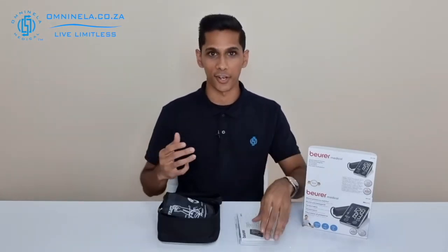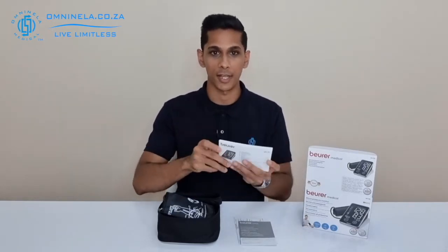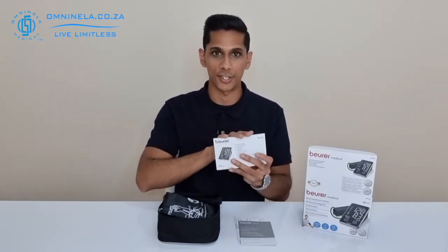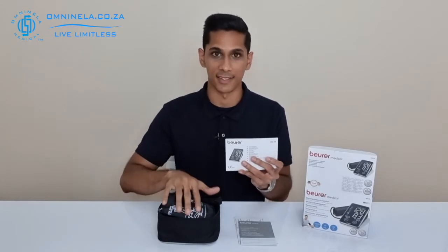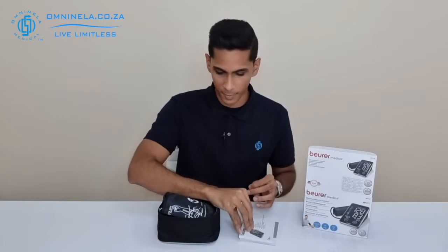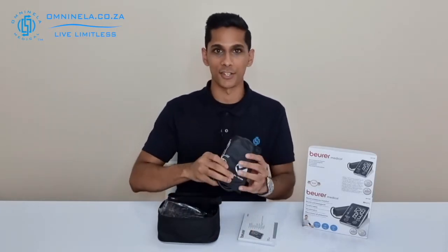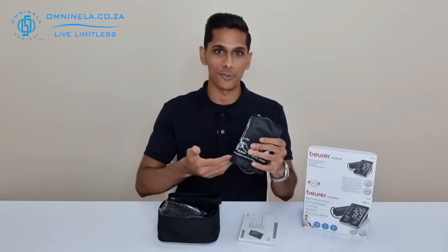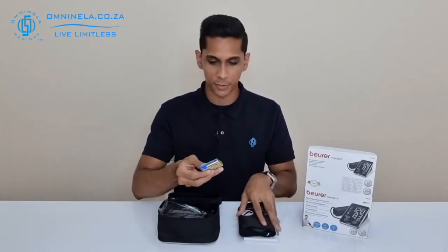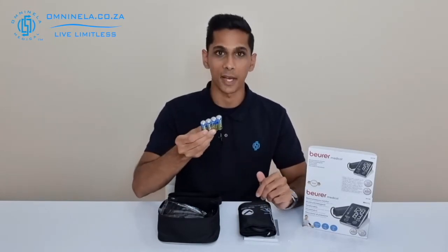Now that we've got everything unboxed, first we can find our instruction manual, which will give you all the instructions you'll need for the use and setup of the device — do go through that as it is extremely helpful. Next we've got the blood pressure cuff, and as mentioned earlier it's a 22 to 30 centimeter cuff. Next we've got our double-A batteries.